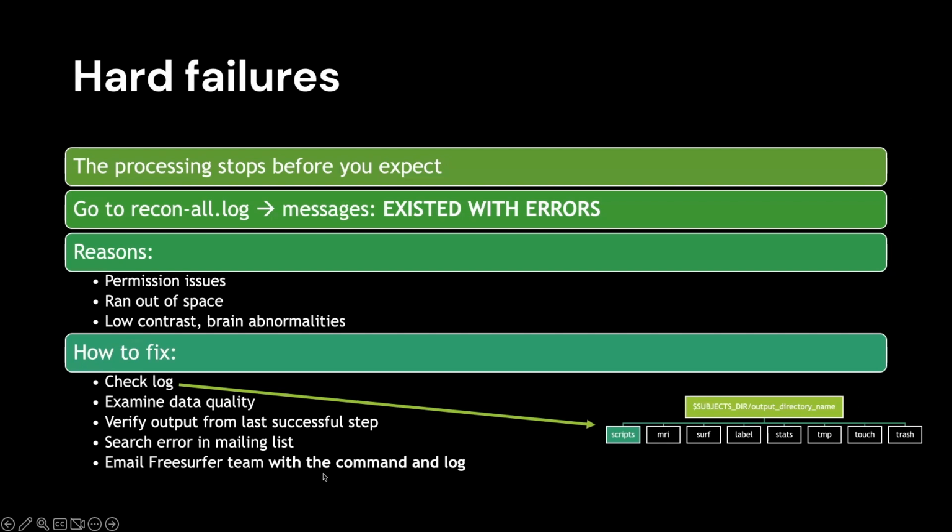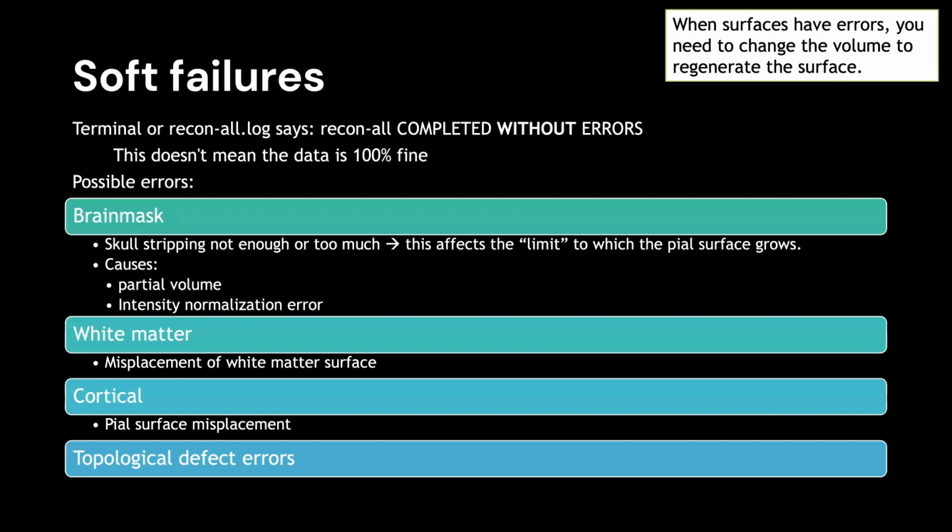Now, soft failures. These are the tricky ones because they are the ones that we need to actually work on and correct on the image itself. So if it's a soft failure, the terminal or the recon-all log will say recon-all completed without errors. However, that doesn't mean that the data and the output is 100% fine.